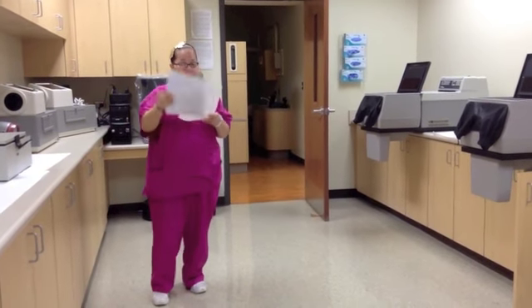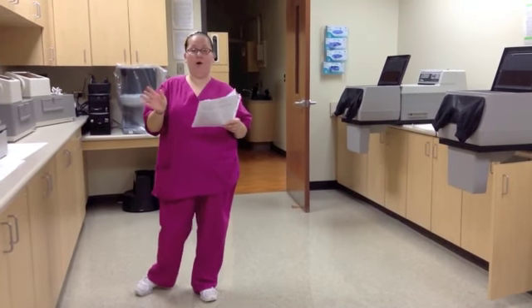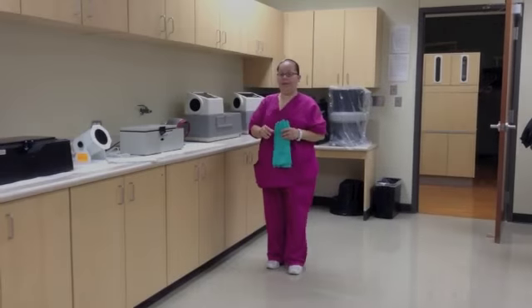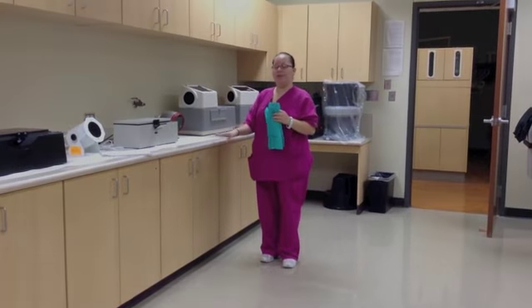After we file, process, and mount any of the x-rays that need to be done, we're going to follow the manufacturer's instructions to shut down the automatic processors. And then we're going to turn off the water supply tank to the manual processing tanks. After that, we are going to wipe the counters, but before wiping the counters, we will put on our utility gloves. We'll wipe the counters and then turn off the safety lights.